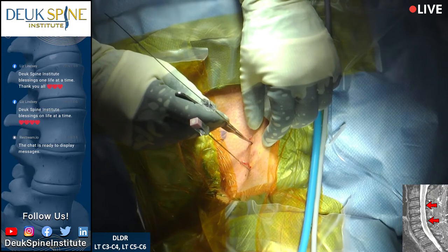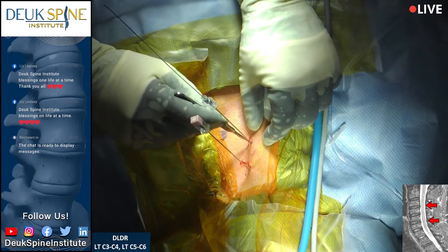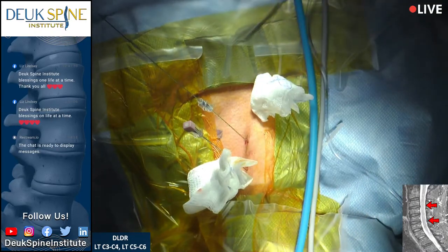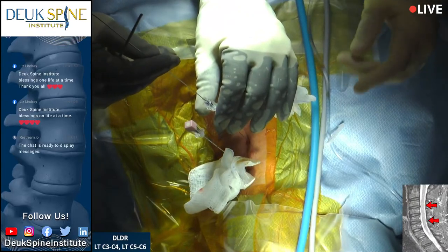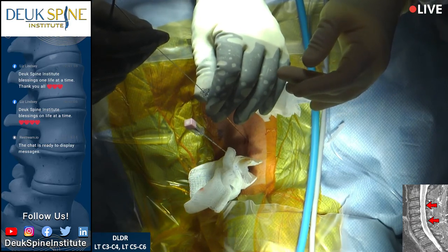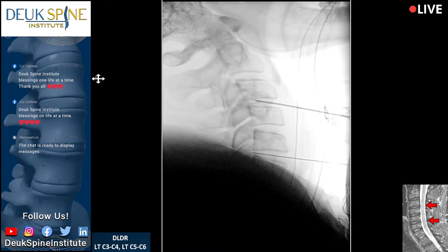I'm only going to make one incision right now. You can see how tiny it is — 4 millimeters. I want to keep my guide wire in place while I take the spinal needle out. Now we're going to bring the dilator down — you see it, the tip is tapered. The guide wire is bent just a little bit; it's probably okay but we have to be careful.